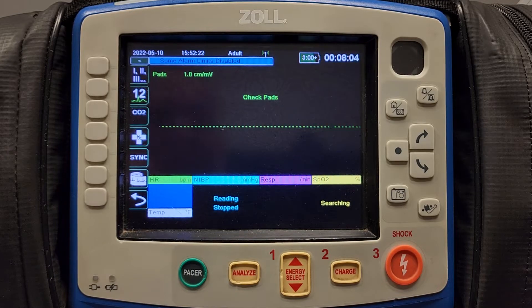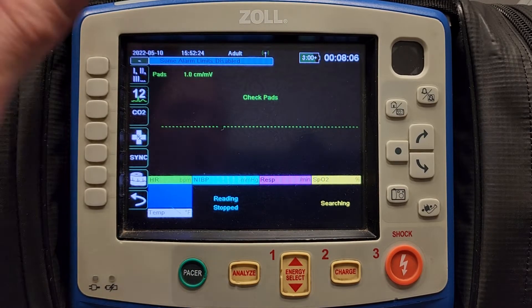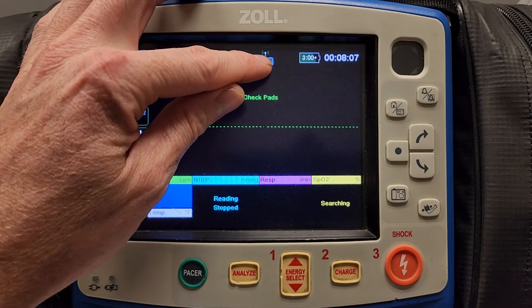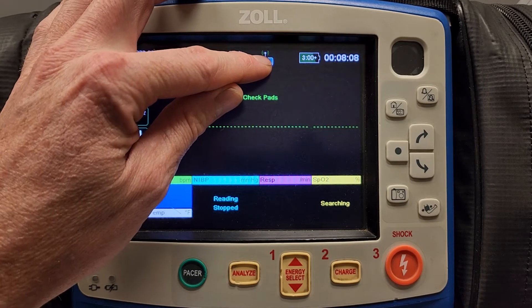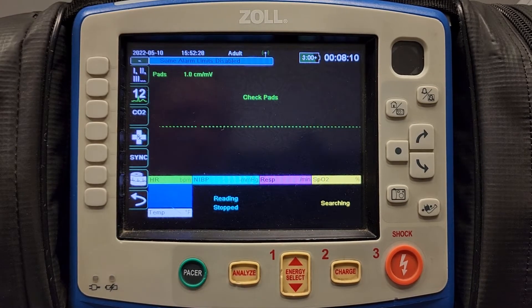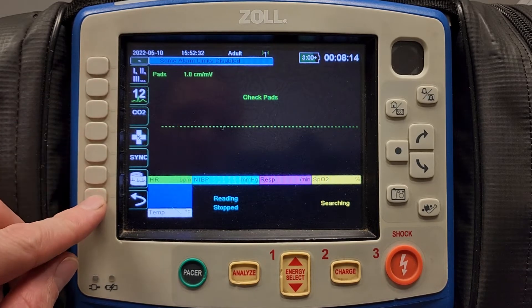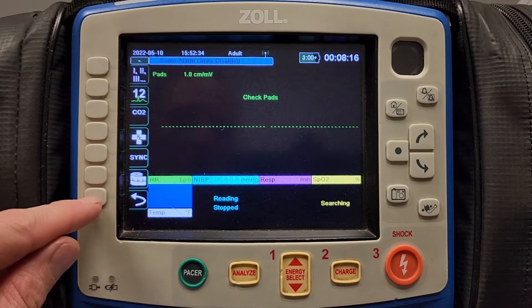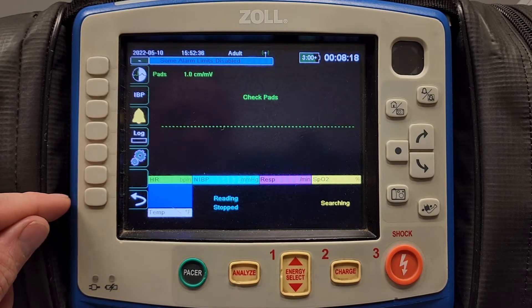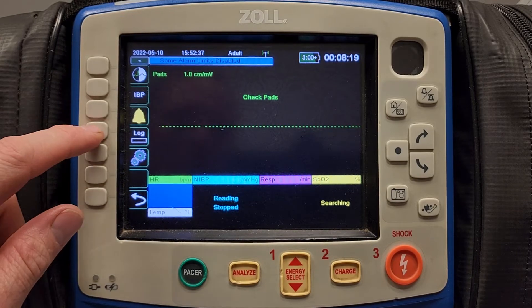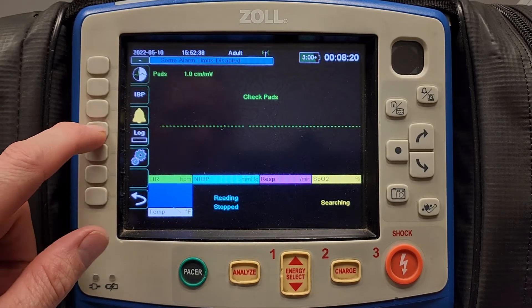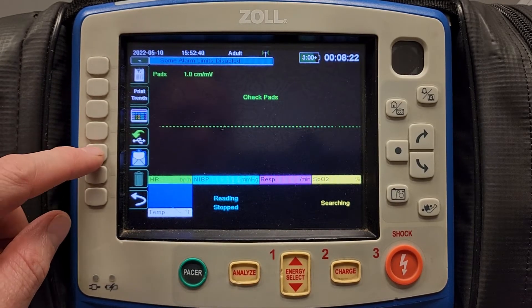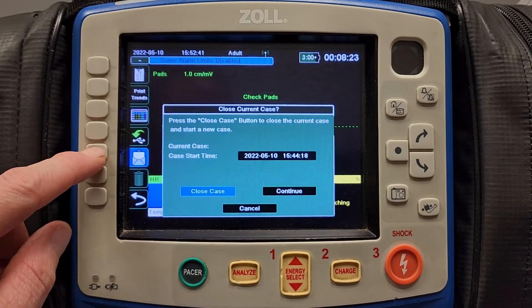To upload vital signs to the Zoll Cloud, first you have to make sure that you are connected to a Wi-Fi access point. Once you are connected, come to the left column and hit the bottom arrow, which will take you to the second screen, then hit the log icon and then hit the envelope icon.